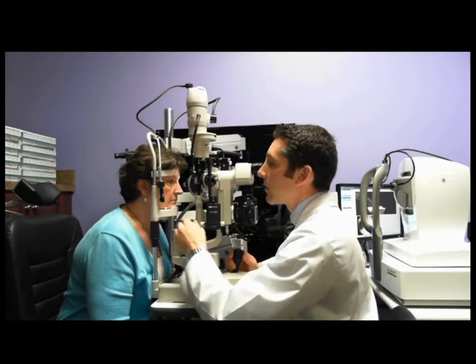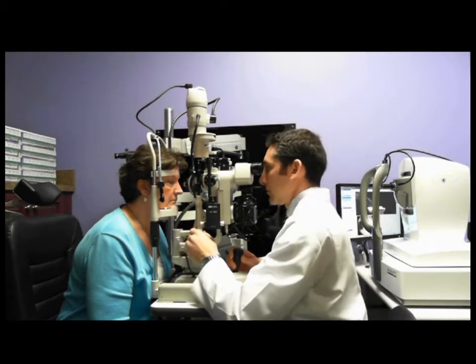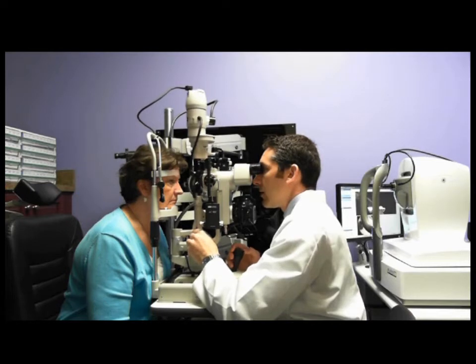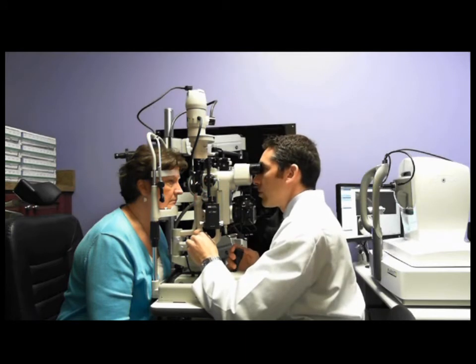Okay, let's look at the other eye now. Okay, so likewise, there's poor wetting on the front surface of this lens, but it's actually better than the other eye, so I don't think we need to squeegee this eye.